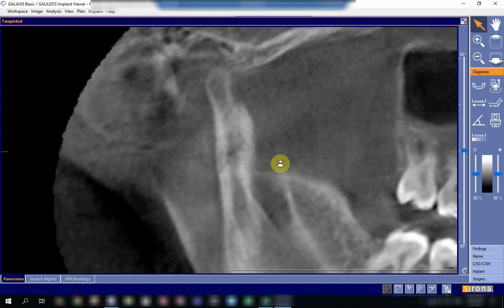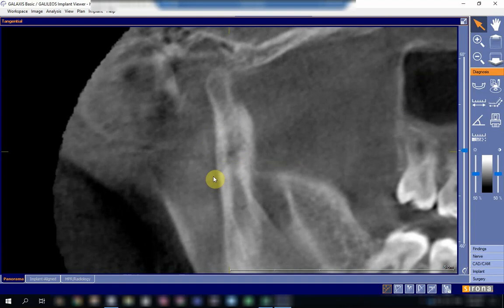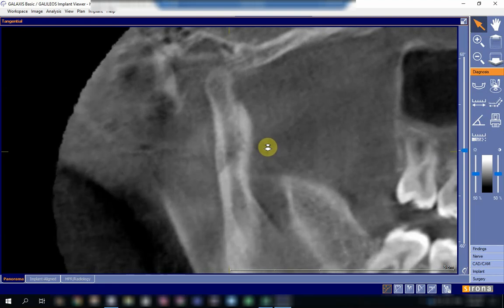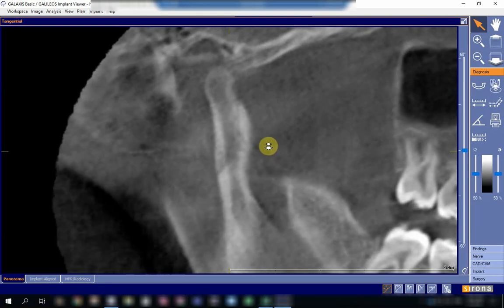I'm moving again. The fracture line is extending from the posterior border of the ramus, upwards obliquely, going up in this direction. But let us find if it is going full thickness.